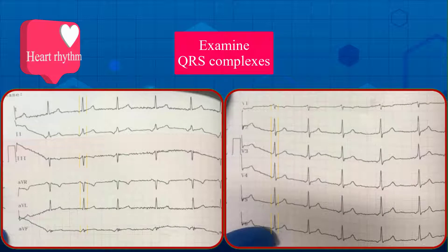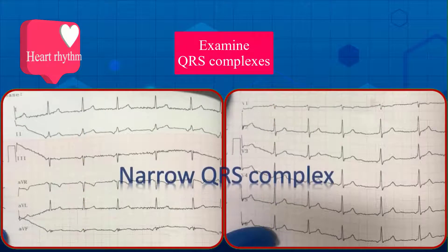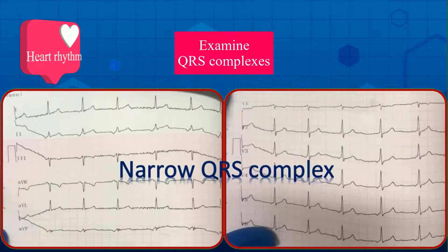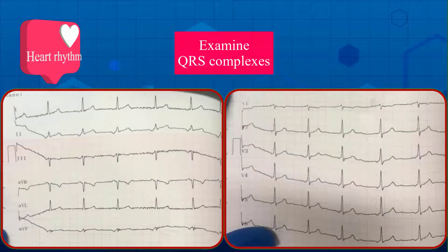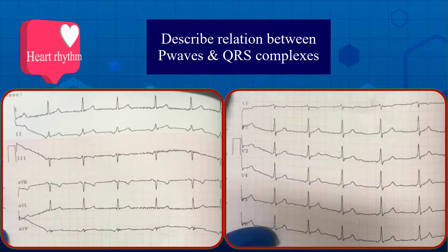Two: locate and examine QRS complex morphology. Here the QRS complexes are uniform; the duration is less than 100 milliseconds, so the complexes are narrow. Three: describe the relationship between the QRS complexes and P waves using the P-QRS ratio and intervals — including RR interval, PP interval, and PR interval.